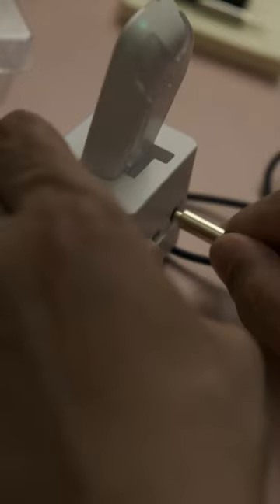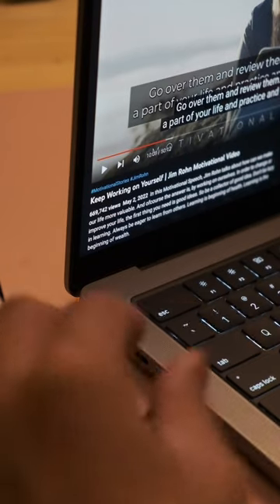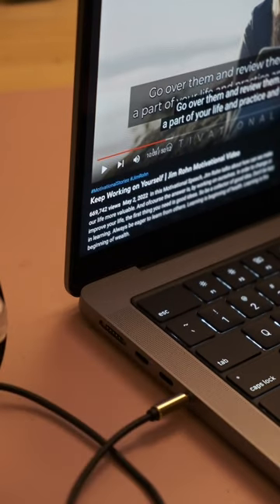Place your AudioLink to your docking station. Insert the 3.5mm jack to the audio input socket of your AudioLink docking station. Connect the 3.5mm jack to the audio output of your laptop or computer.